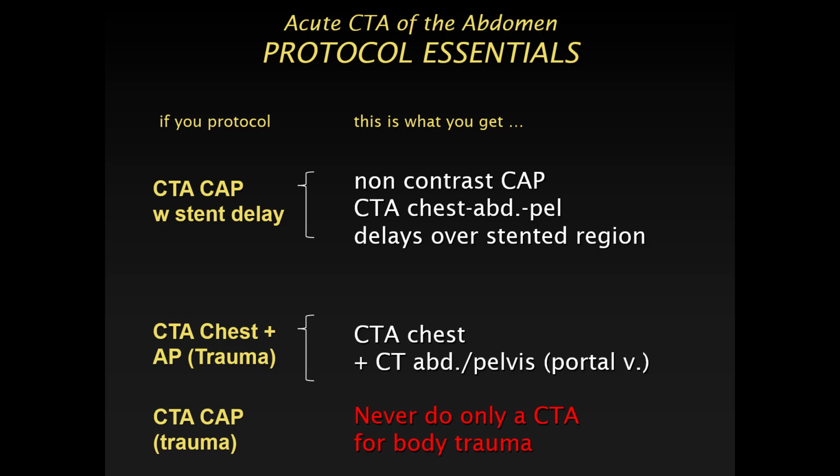And the reason these problems usually happen is when the ED or the trauma team think, or know from an outside study, that there is some active extravasation from some vessel somewhere, and then they don't order the routine protocol, but they order a CT angio chest, abdomen, pelvis.